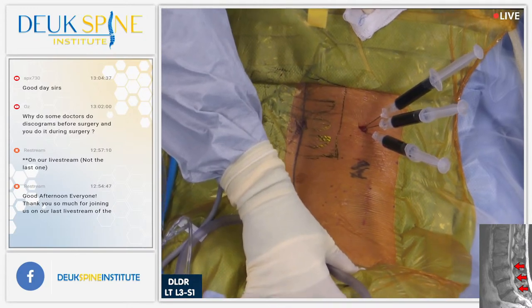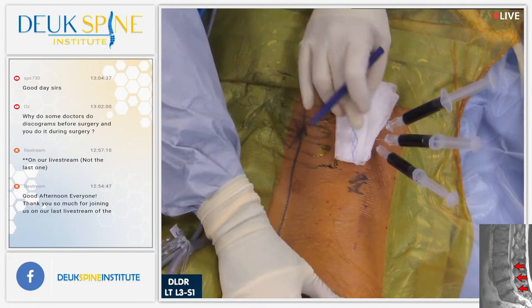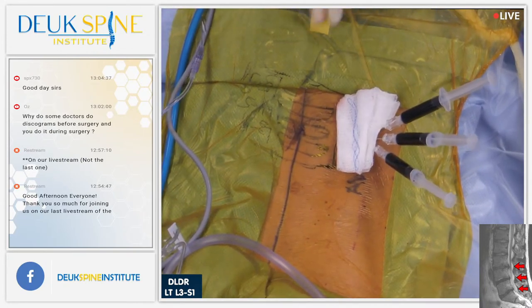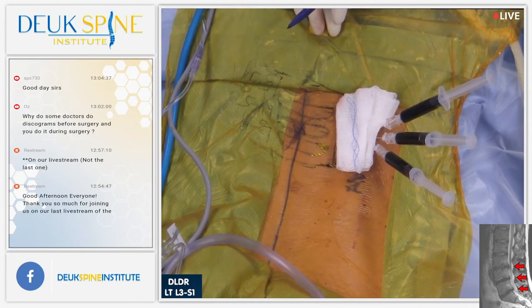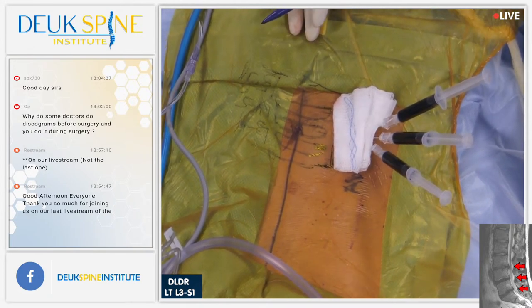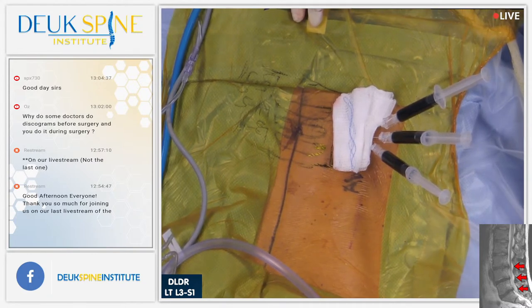Okay. So, the two things that we need patients to help us with. Number one is make sure we're not too close to the nerves. Number two, I want to make sure these discs are really the cause of his pain, which I'm 99.99% sure. But it's always nice to know, is that your typical pain that he gets, and how bad is it on a scale of 1 to 10? So we're going to ask him that question in a moment.